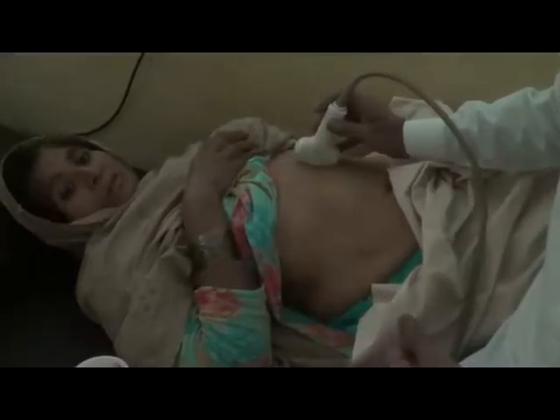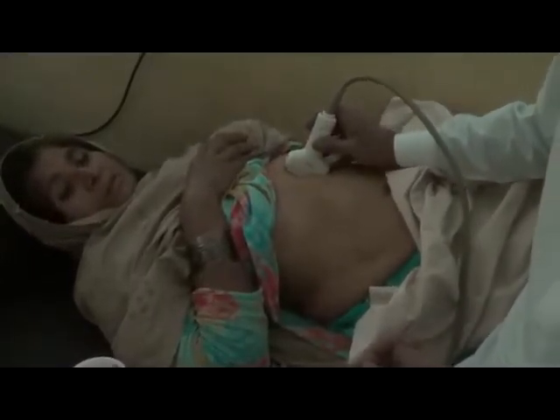This ultrasound scan of a 55-year-old female, first in supine posture, you can see a scar line. This scar line is that of a cholecystectomy that she had about a year back, and below this we see a very hard immobile mass.